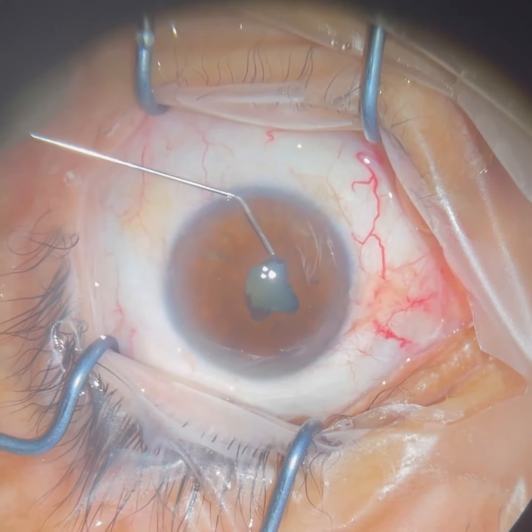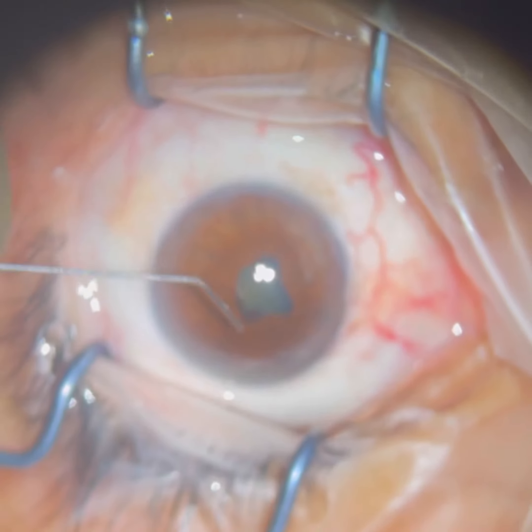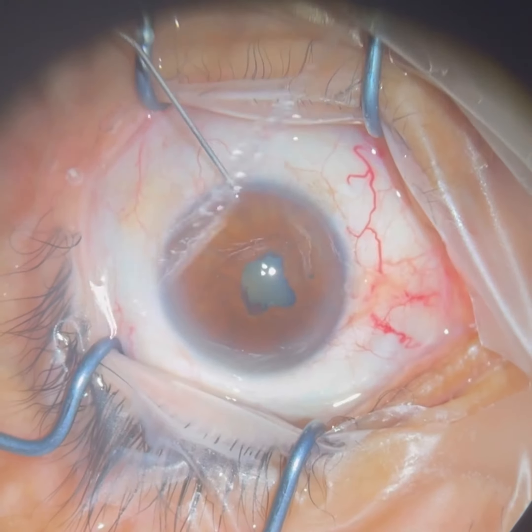Hi, this is Dr. Ahem Scaff with California Retina Associates. Today we're showing a slightly complicated cataract surgery.